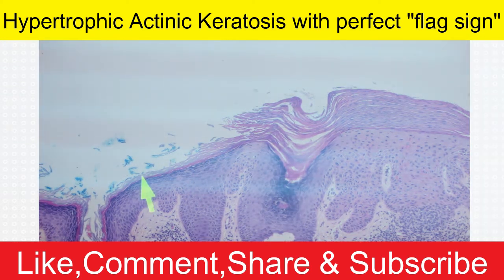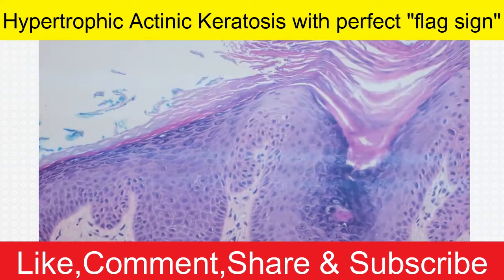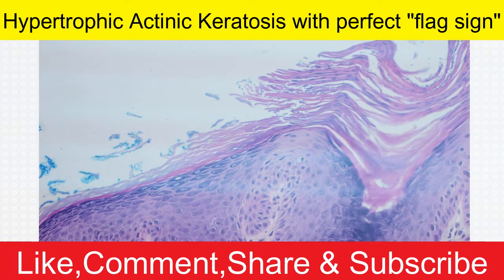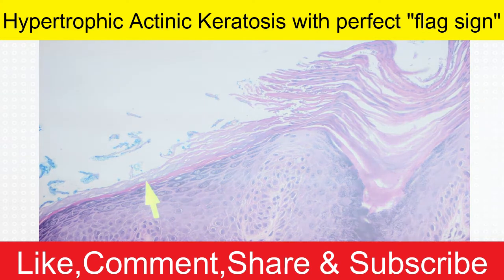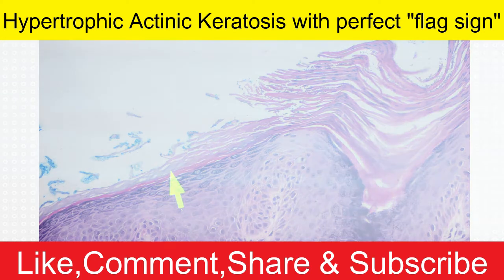In this case, the orthokeratin is a little compacted together, and the granular layer is thicker than usual, and that's because this patient has been picking and scratching at their actinic keratosis. So this is a reactive change of the epidermis. It gets thicker, with hypergranulosis, and it gets compact, dense keratin. It has a little band here that we call the stratum lucidum, which is normally only present in the palms and soles or in skin that's been scratched. This process is called lichenification, or lichen simplex chronicus. It's a reactive thickening of the epidermis from scratching.